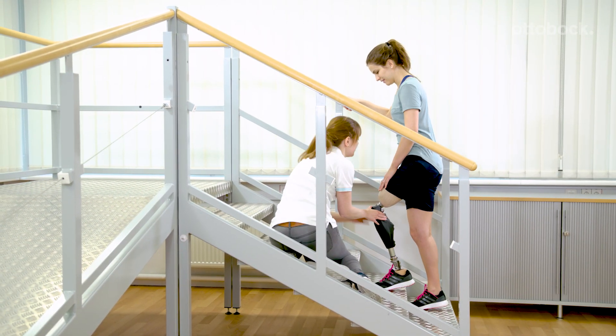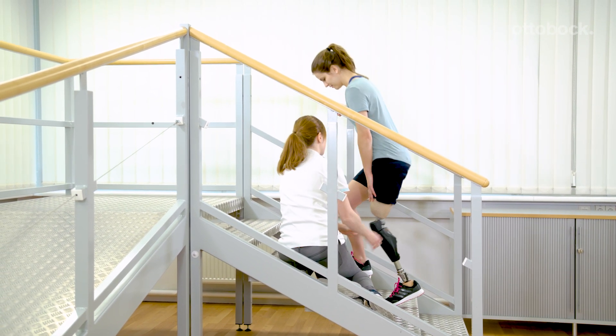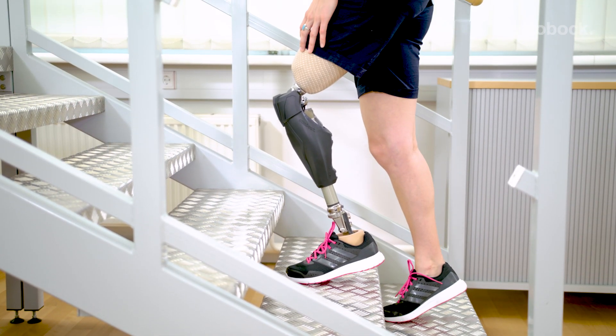As a trust-building exercise, place the prosthetic foot only on the forefoot. Reka steps over the blocked and flexed knee joint while fully loading the prosthesis.